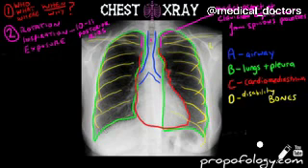You're going to start at the posterior aspect of the ribs, which is shown now. And you're going to work your way forward with each of them, looking for fractures in all of these bones, or any displacement. Any fracture or displacement could imply damage to underlying structures.